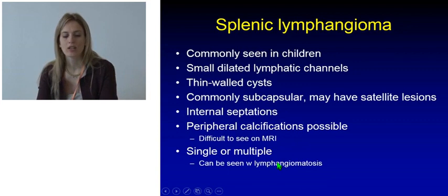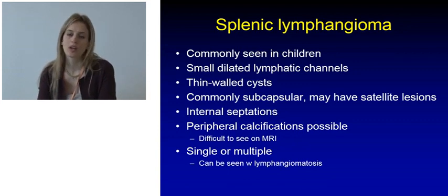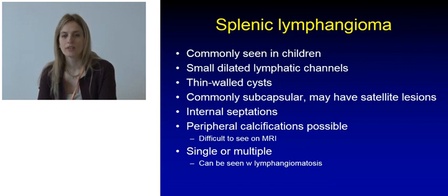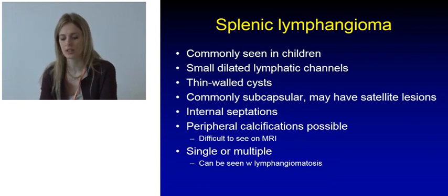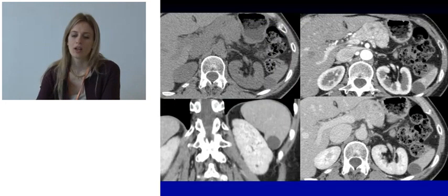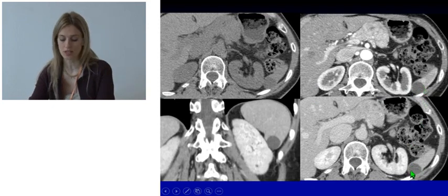Splenic lymphangioma is commonly seen in children and is due to a dilation of small lymphatic channels which form thin-walled cysts. They are typically subcapsular and there may be satellite lesions. These lesions usually have internal very thin septations and they can show peripheral calcifications. As we can see in this example, there is a subcapsular lesion with thin walls that do not enhance — this is the typical location and appearance of lymphangiomas on CT.